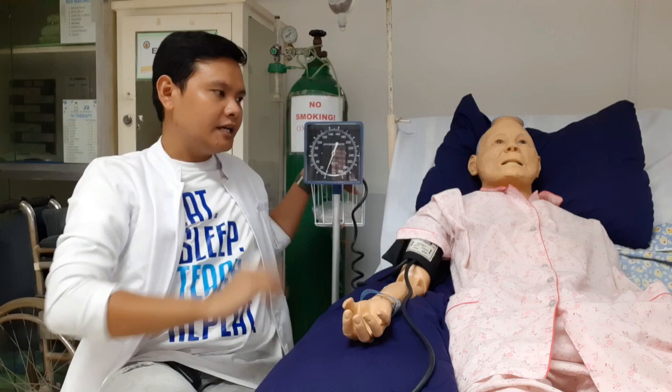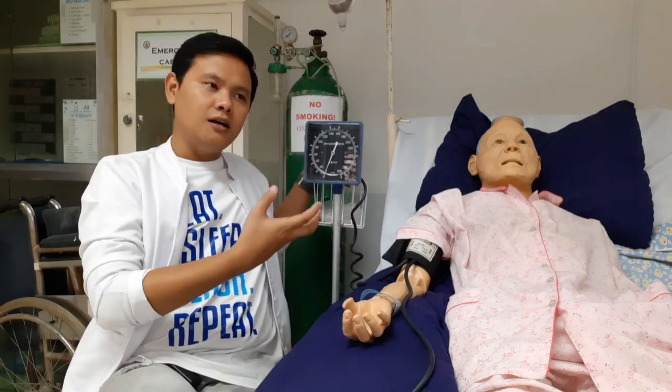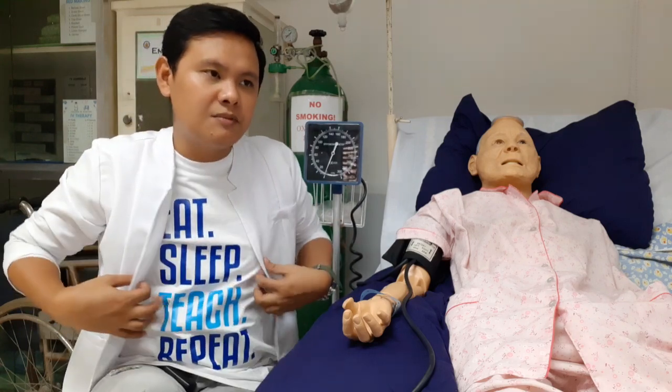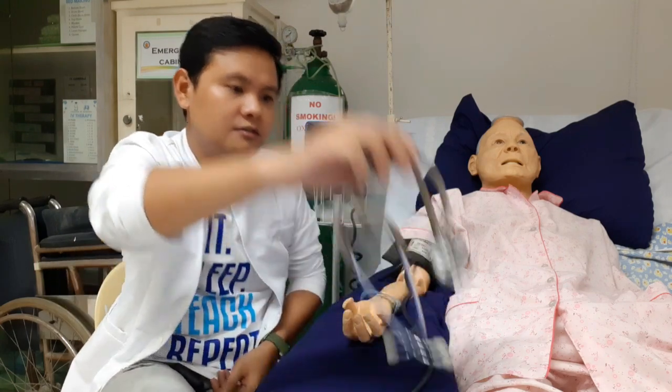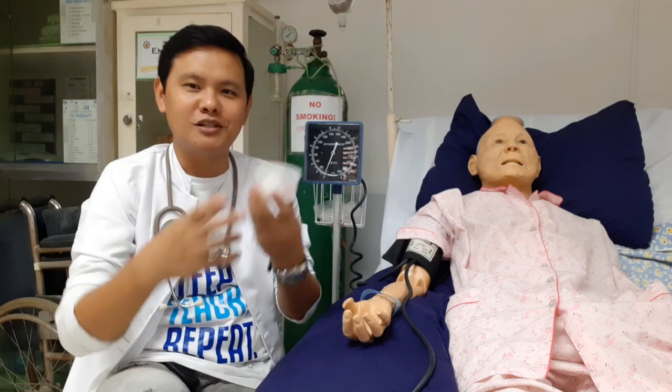Okay, so magkakasama na yan. Dalhin na natin. Kung ang ginagamit natin is katulad na ito, merong gulong, okay, dalhin na natin ito dun sa may pasyente natin. Pero kung ginagamit natin is the portable one, well, why not? Sa hospital, bibihira naman na may gumagamit dyan ng mga digital na BP apparatus. Okay? So what else? We also have to prepare stethoscope. Siyempre, mawala bang stethoscope? Okay, so we have stethoscope. Ano pa? So after preparing all the instruments, materials, cotton balls. Kailangan rin natin ng cotton balls for this procedure. So bakit? Well, later I'm going to tell you. So after planning, let's move on to the implementation.